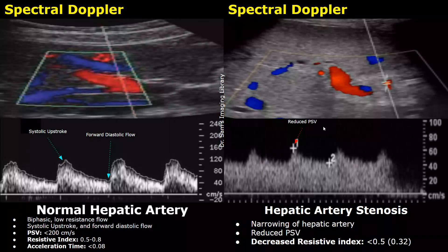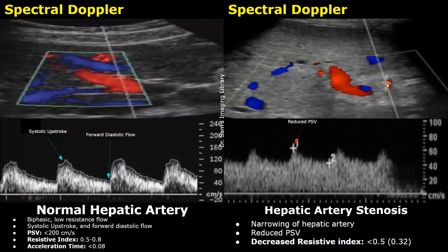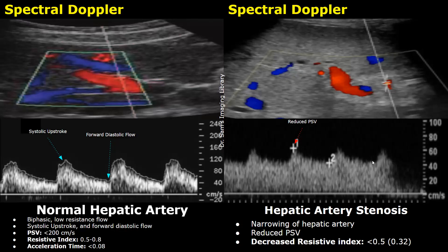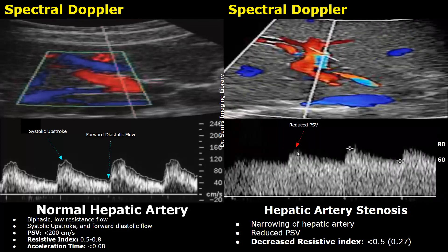Hepatic artery stenosis is another complication of liver transplantation, in which there is narrowing of the hepatic artery due to thrombosis or other causes. When there is stenosis, the PSV can be reduced while the EDV remains normal. Since there is not a significant difference between PSV and EDV, the resistive index is decreased. The PSV here is around 60 cm per second and the EDV is around 50 cm per second. Here is another case of hepatic artery stenosis where the PSV is reduced and the resistive index is reduced as well — it is 0.27 in this case.